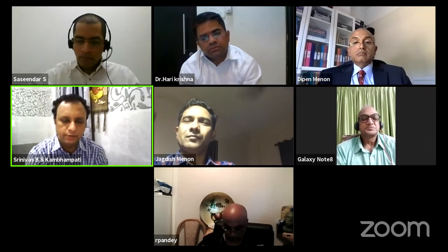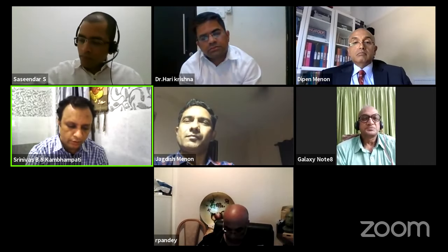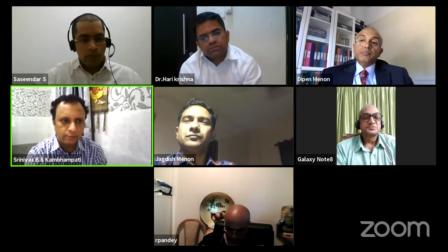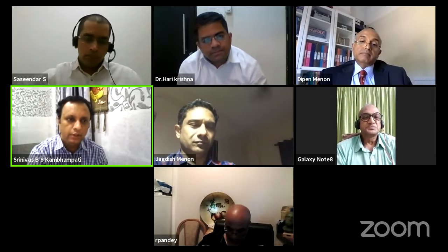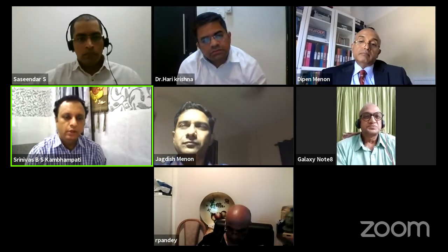Anchors, the types of anchors also: metal anchors. You told about bioabsorbable anchors, biocomposite anchors. Biocomposite are hydroxyapatite coated, and there are screw type anchors, the impaction type of anchors, and toggling type anchors, some expanding anchors. I don't have much experience with the expanding anchors. Maybe our seniors have experience with those.